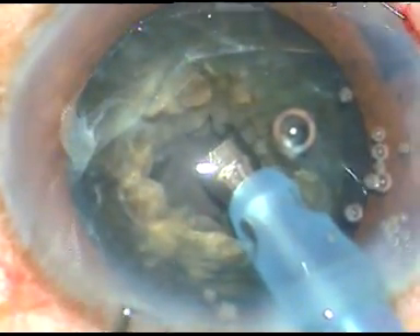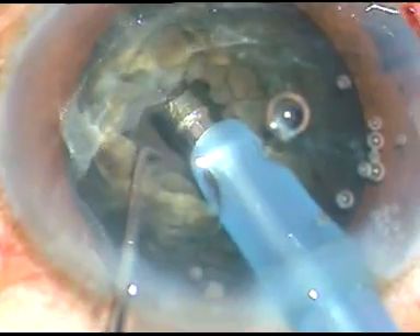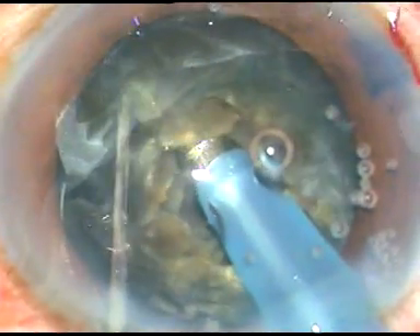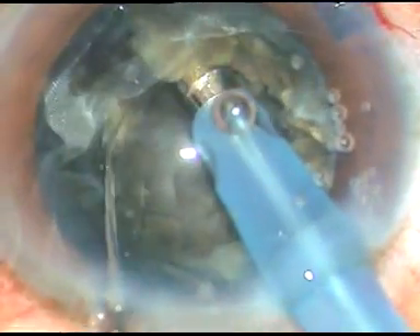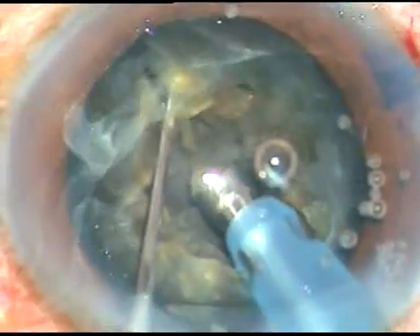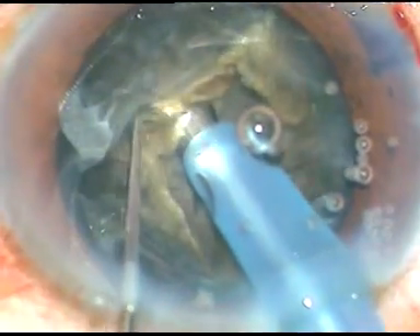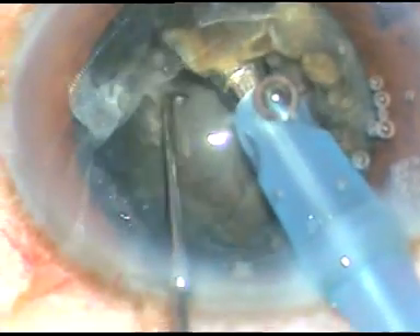Now I am going to chop. I have asked my assistant to set the machine in phaco 2 mode, where at this time the power is 85%, flow rate is 45 ml per minute, and vacuum is 450 mmHg.